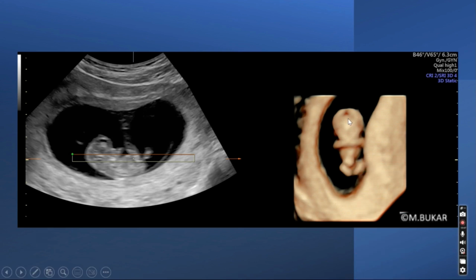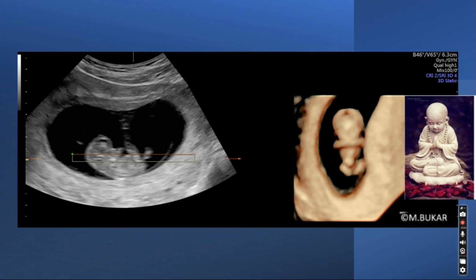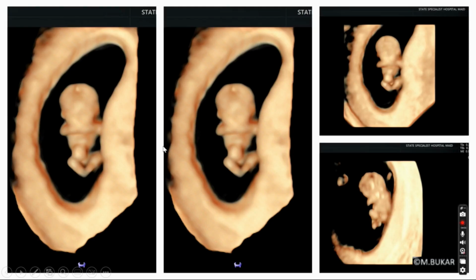Note the posture of this fetus and compare with this other posture. These are images using Magicut, and these are without Magicut, all depicting the physiological hernia.